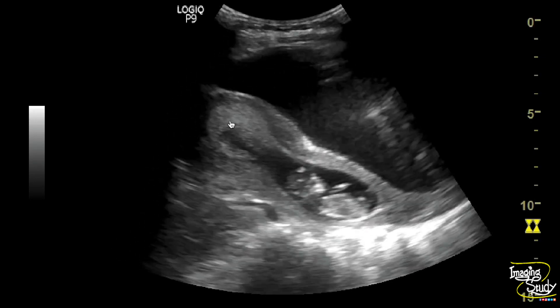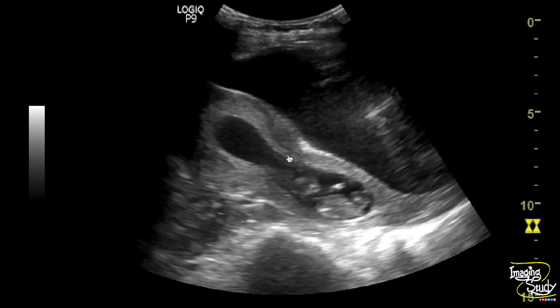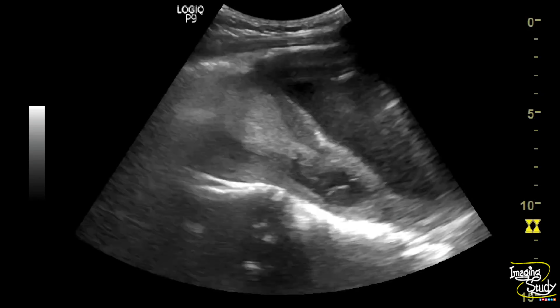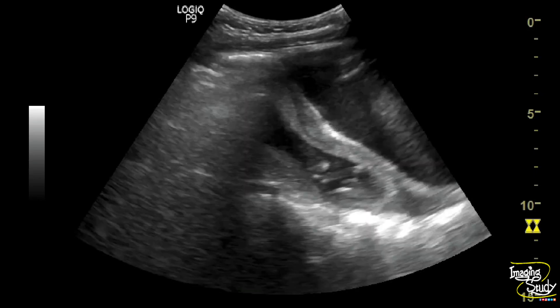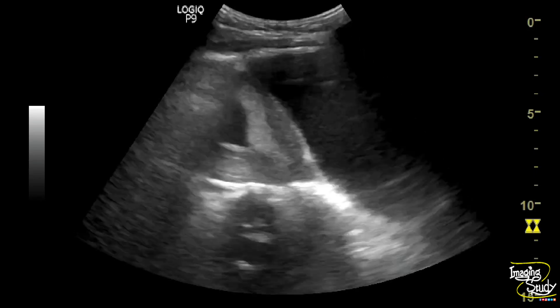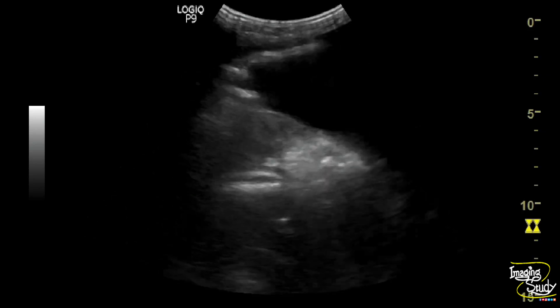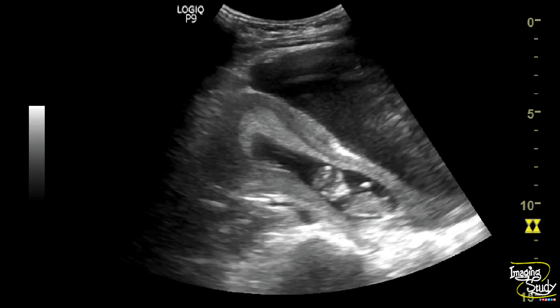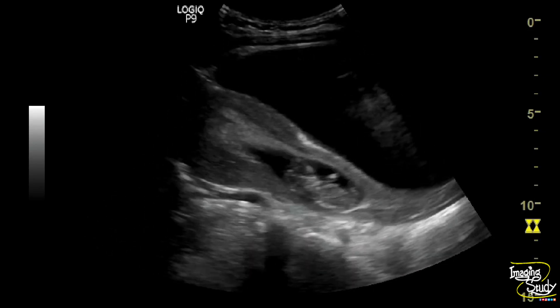This area is the growing placenta. As the internal os is dilated and the fetus has descended to the cervical cavity, these features concluded as a case of inevitable abortion.